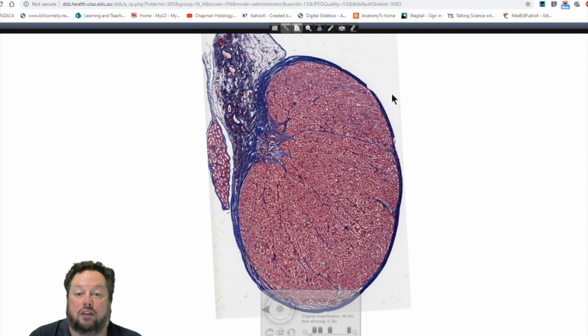And within each lobule we have 2 to 4 seminiferous tubules, which are sort of blind ending tubules within the testis. After you drew it out, I found it really useful having a schematic diagram like this before going straight into the actual histodiagrams in the lectures. At least I know what I'm looking at. I'm glad that helps, because it can be a little bit complicated to work out where everything is taking place there. Great. All right. So we've got these nice connective tissue septa.